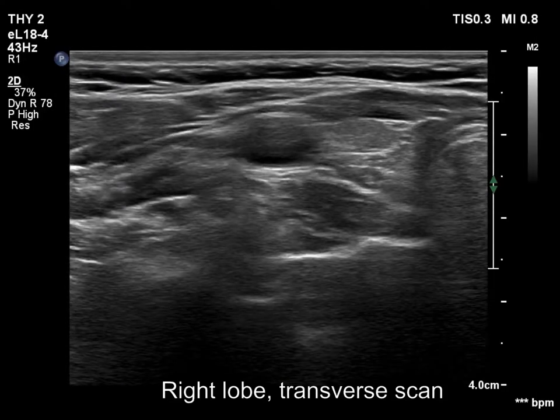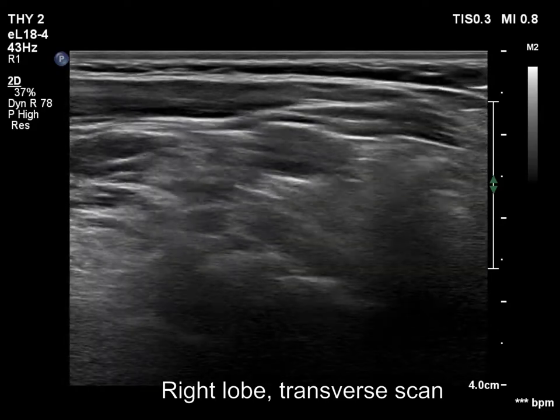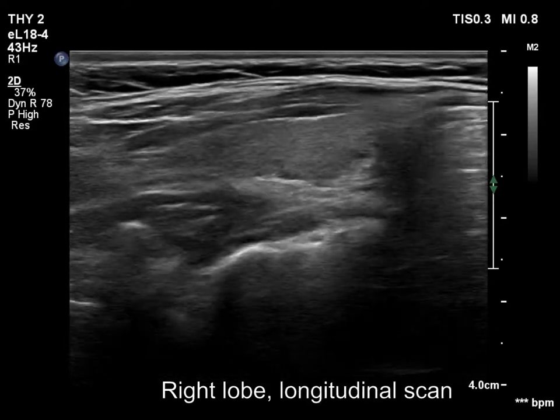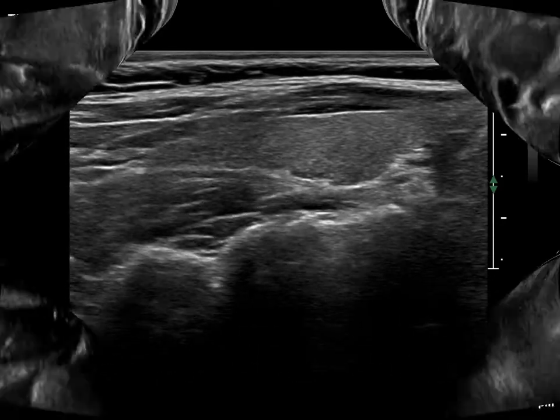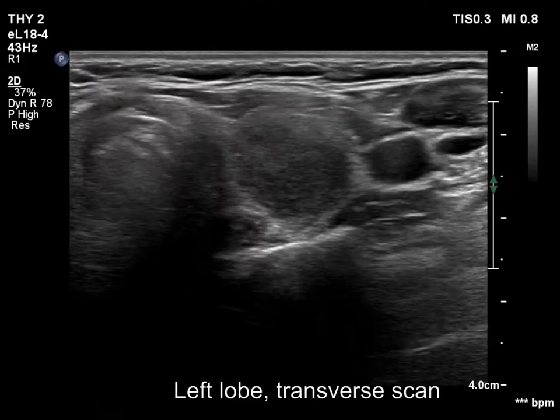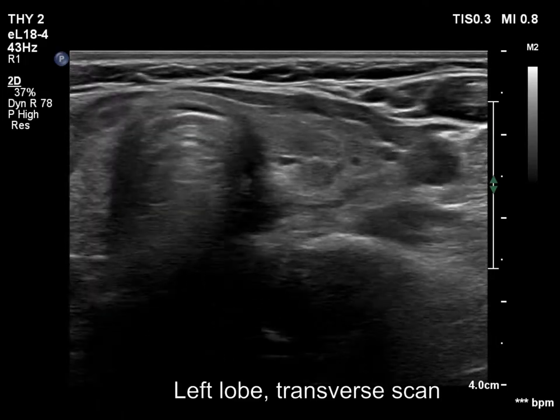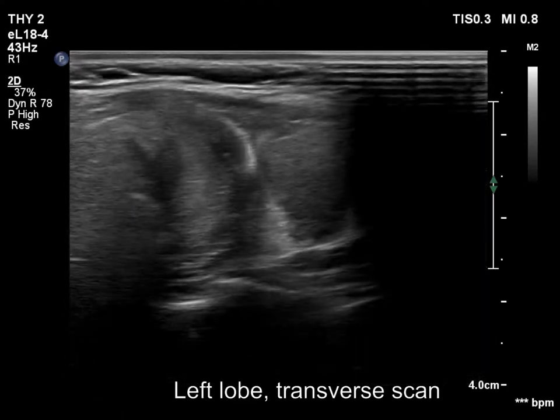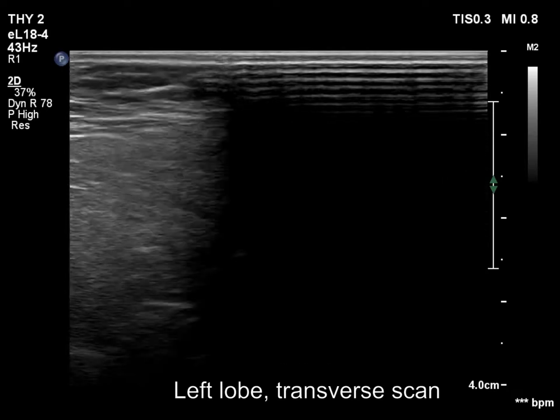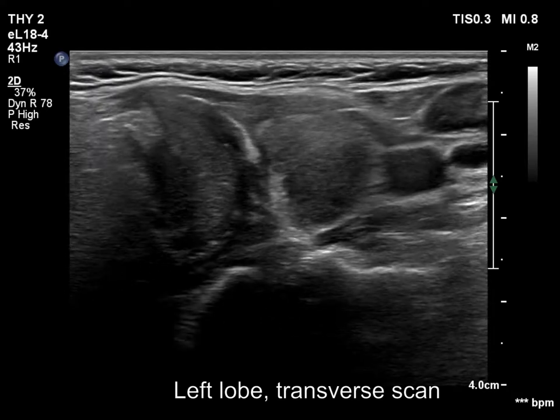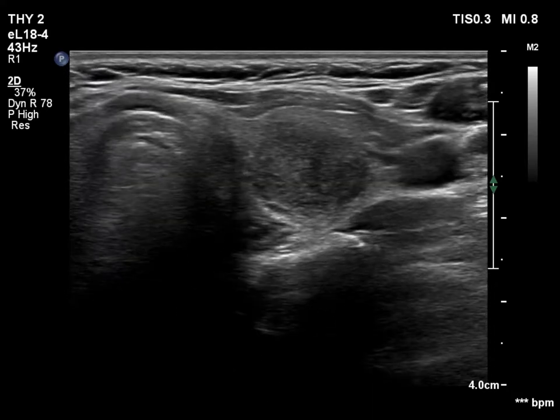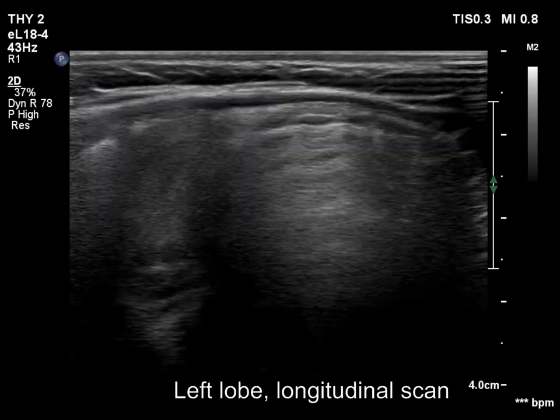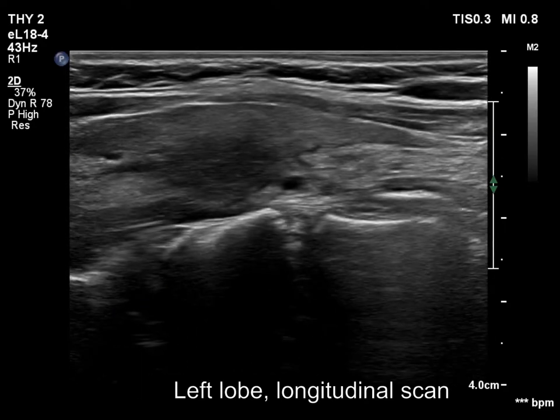The right lobe is decreased in size and is composed of minimally hypoechoic and echomal areas. A relatively large, moderately hypoechoic lesion has appeared. The borders of the lesion are ill-defined not only at the outer surface but also within the lesion. This makes the appearance cloudy.